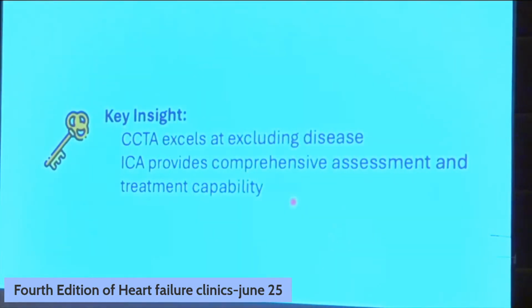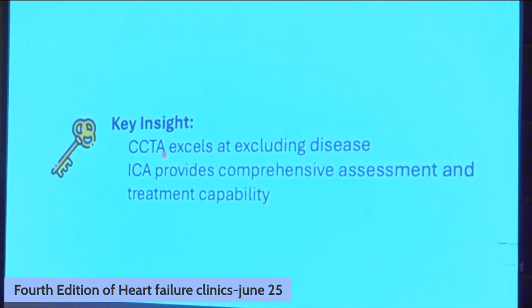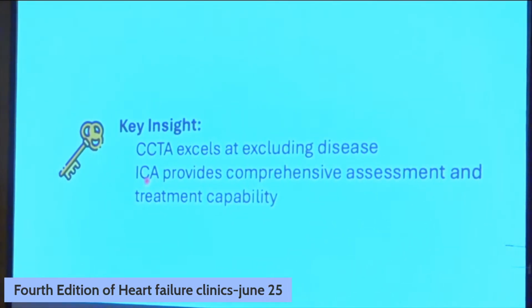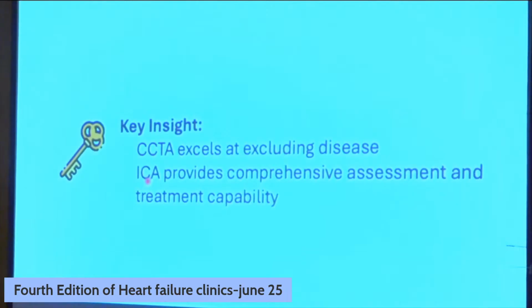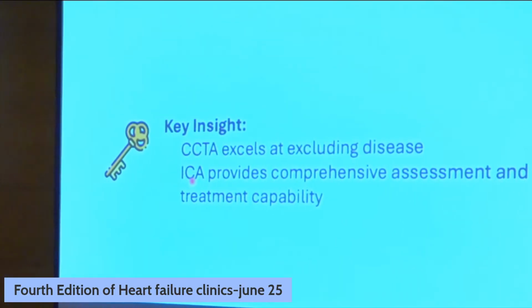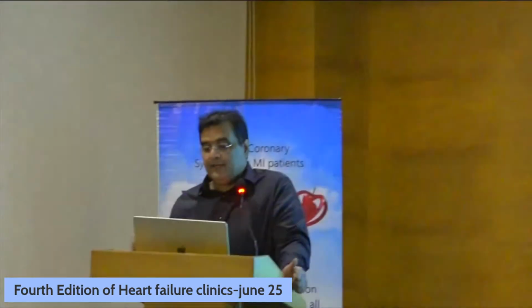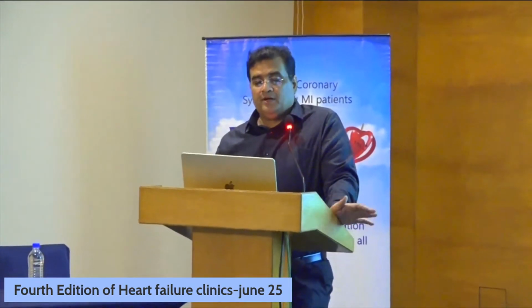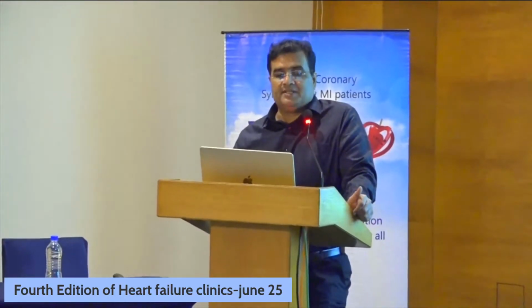So, in conclusion, coronary CT excludes disease, whereas invasive coronary angiography provides a comprehensive assessment of the coronary artery disease. So, as an initial test, I am doing CT coronary angiography. I think it has very good utility and is very fast in our patients.